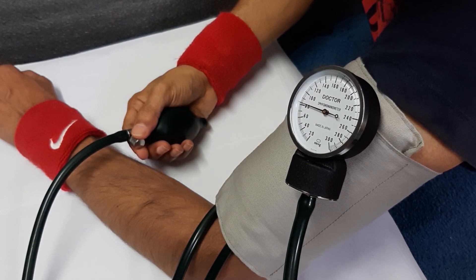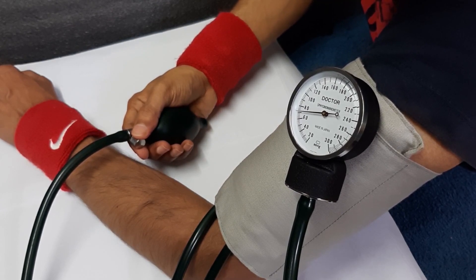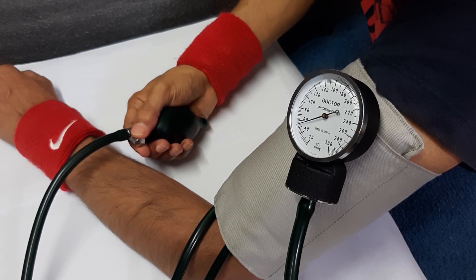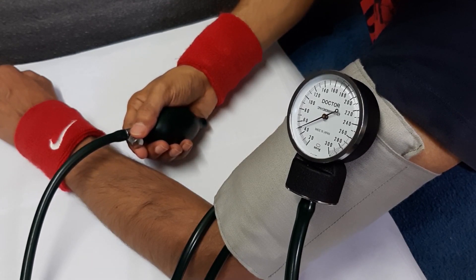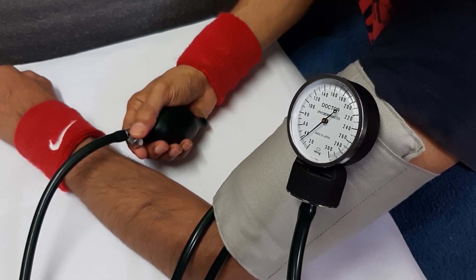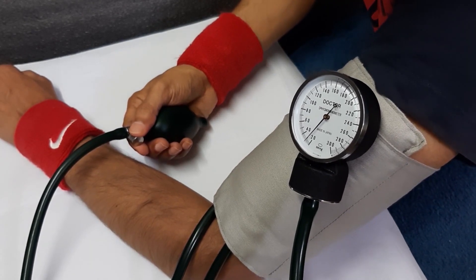The last fluctuation of the needle is the diastolic pressure. Mine is normal. Normal blood pressure is 120 over 80 mmHg.